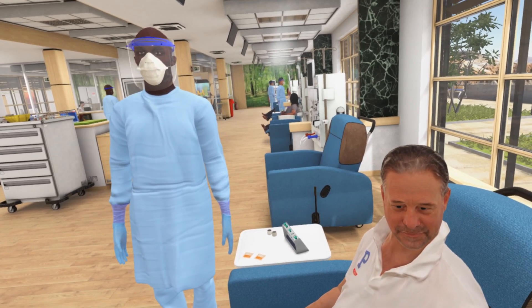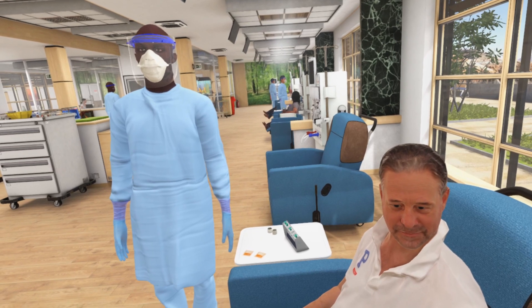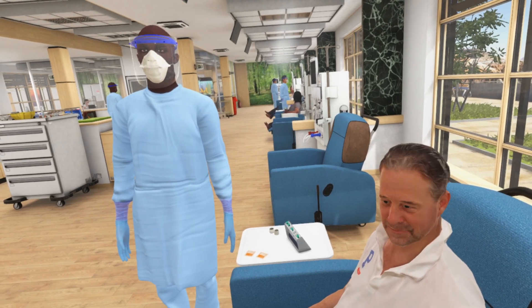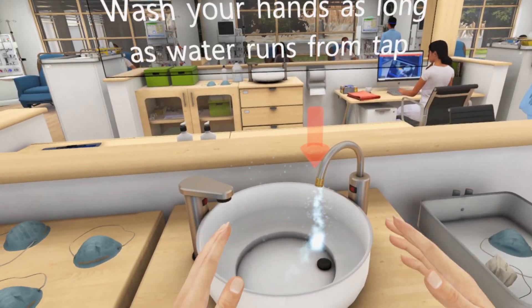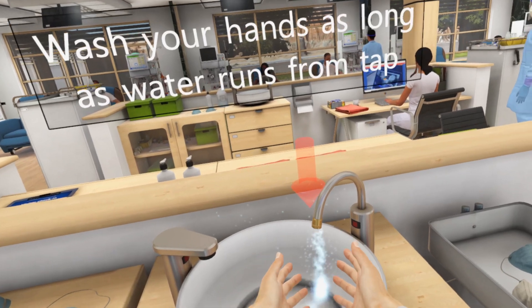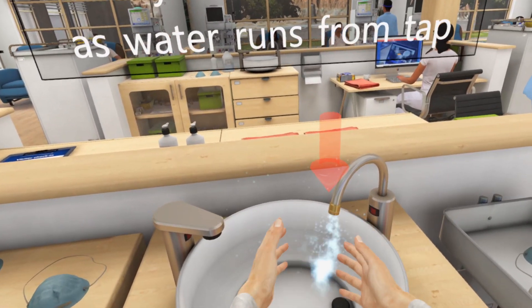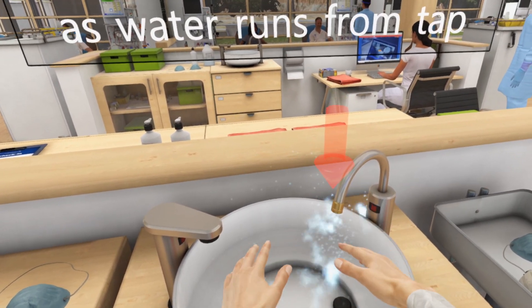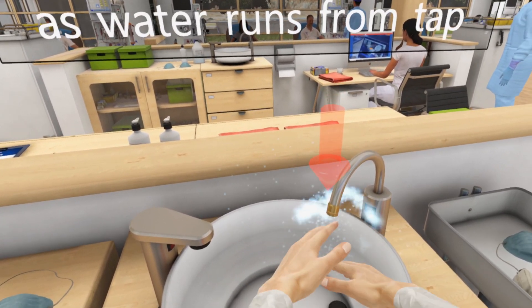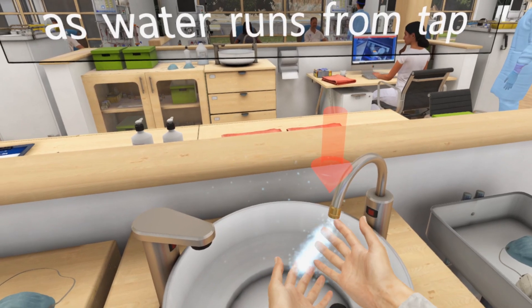You're going to be assisting me as we do very important tasks to help our patient. Please wash your hands thoroughly with soap. Be sure to wash in between your fingers and under your nails.